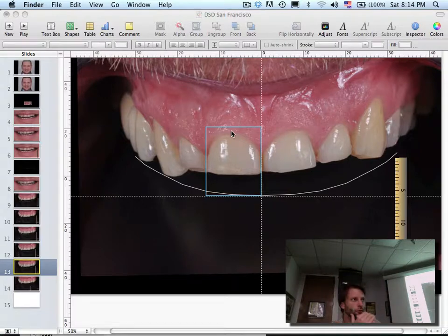So maybe you have some room of enamel. It looks like he has enamel underneath the tissue. So that becomes very easy for you to make a gingivoplasty without having to open a flap or shape the bone. So this is a good indication that you can actually play with the margins a little bit in a very simple way. So this is nice if the dentist gives the technician this freedom, saying that if you want, you can have 1 millimeter of subgingival enamel that we can easily remove, and we can improve the proportion without having to make any other complex procedure.